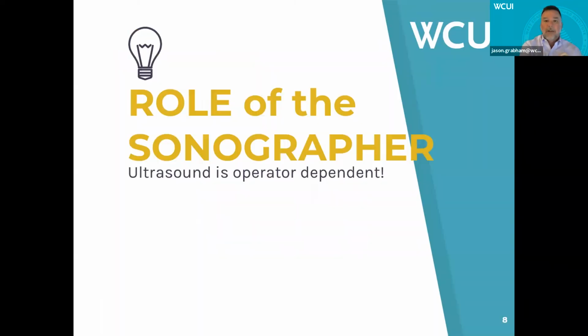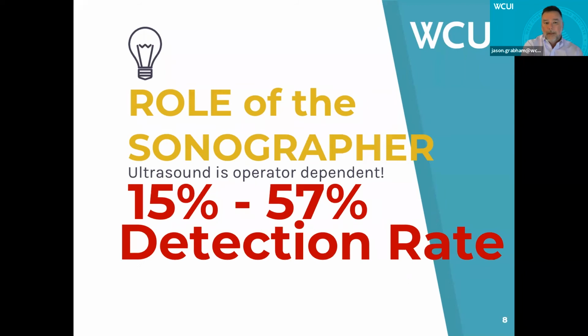So what's the role of the sonographer in all this? And I would say the sonographer, you guys out in the field, this is where it all starts. Ultrasound is the most operator dependent of any medical imaging modality out there. It truly, truly is. Everything depends on the images that you acquire. And in fact, when we talk about this 15 to 57% detection rate of congenital heart disease in that second trimester, it speaks directly to the operator dependency of this modality. Experience levels, education levels, that all plays a part in this.